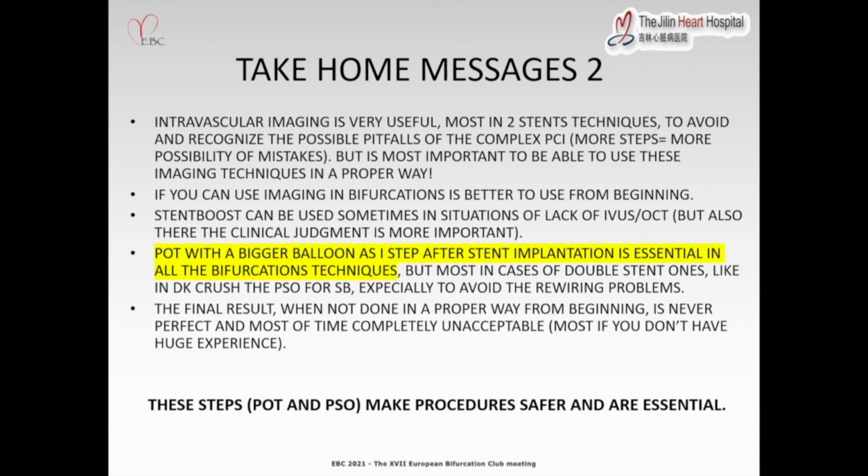POT with a bigger balloon as a first step after stent implantation is essential in all bifurcation techniques, but most of all in cases of double stent, like in DK crush, and PSO for the side branch, especially to avoid rewiring problems.